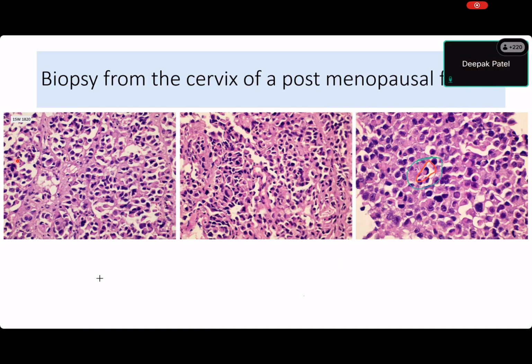It looks more like a squamous cell. Why is it a squamous cell? Can you describe the cell, please, Deepak? Come on, Deepak. You said it was squamous cells, so please describe the cell. Eosinophilic cytoplasm with hyperchromatic nuclei. There is eosinophilic cytoplasm. Very good. And hyperchromatic nucleus. Yes. So that makes it a squamous cell? Why is it a squamous cell?